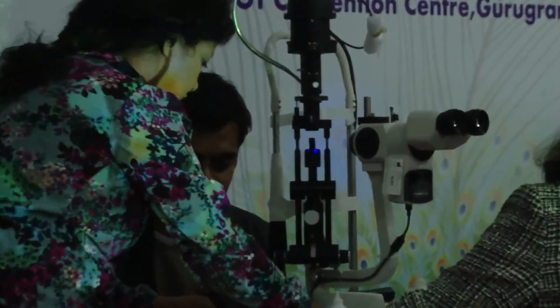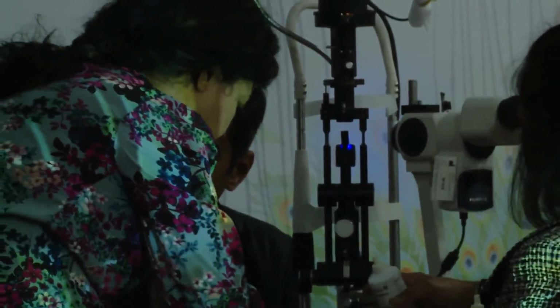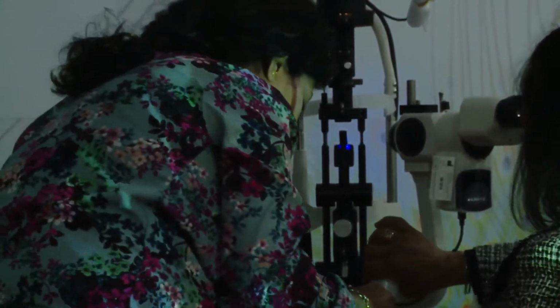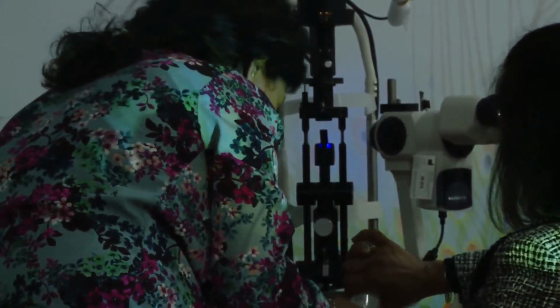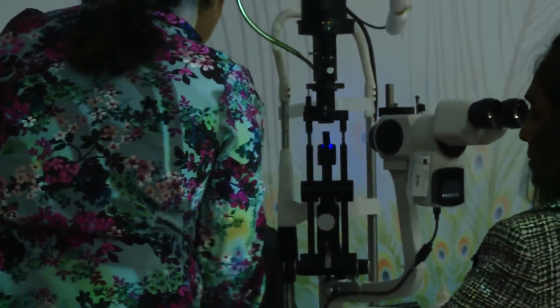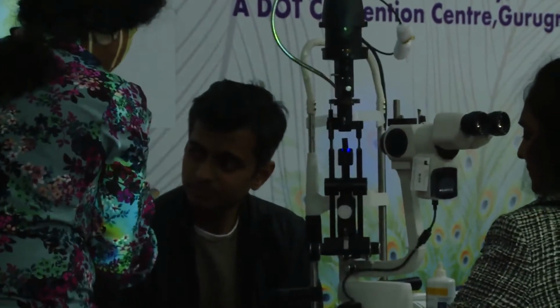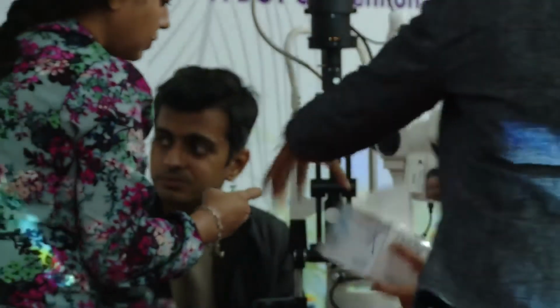So the first lens we tried was 7.6, but it was definitely flat. So we're going to go on Monica's decision, 0.4 steeper, and try a 7.2. Because what we were seeing is touch here, and touch here. And that will cause us problems.